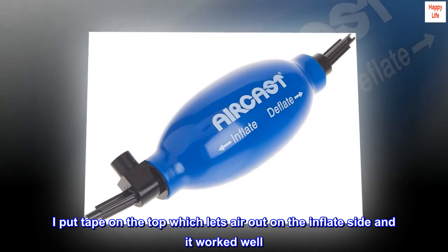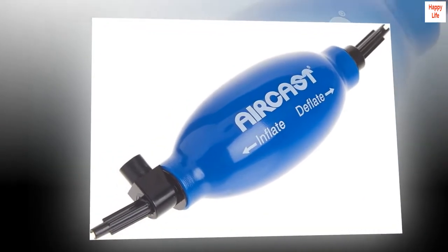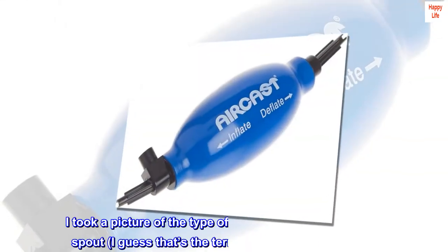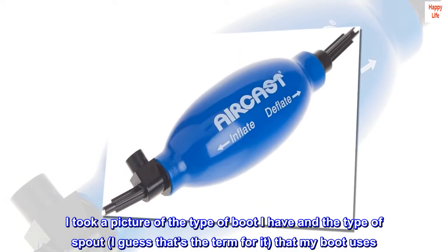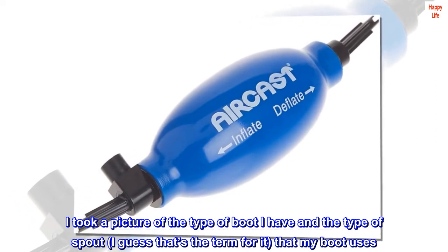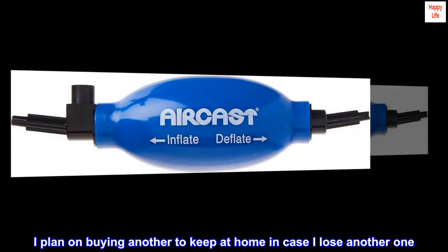I put tape on the top which lets air out on the inflate side and it worked well — that's the white on the product picture. I took a picture of the type of boot I have and the type of spout that my boot uses. I plan on buying another to keep at home in case I lose another one.